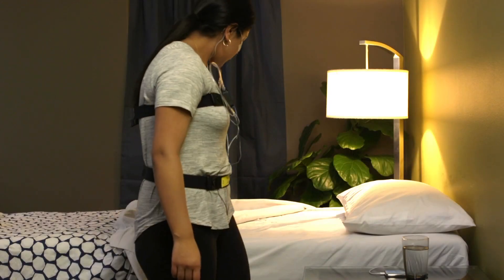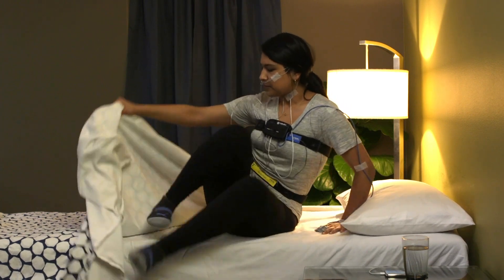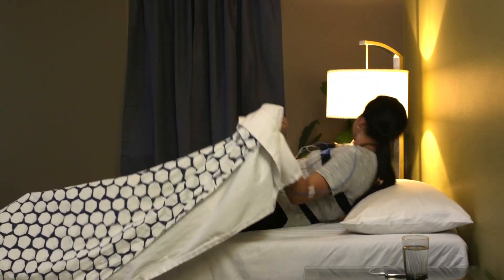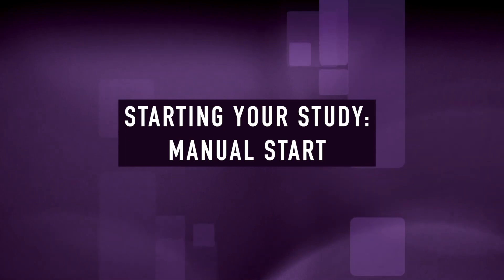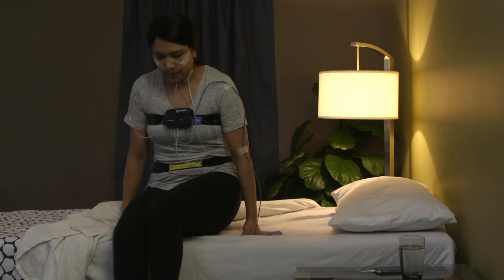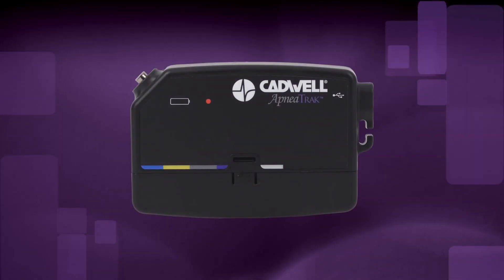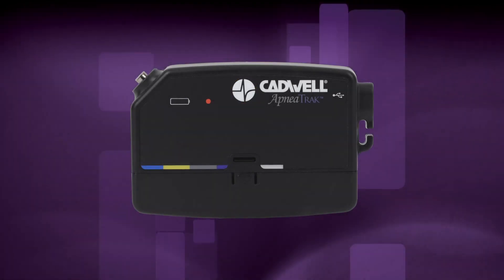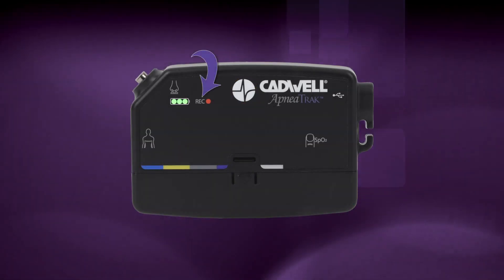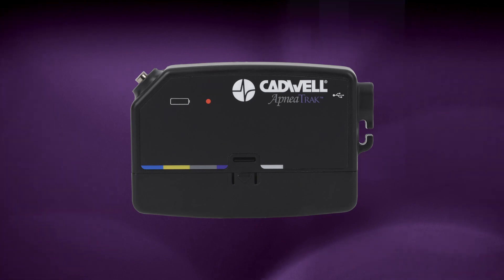If your provider set an auto start time, you don't need to do anything to start the recording — just go to bed and the device will start at the correct time. If your provider instructed you to hold the button to start the recording, press and hold the raised Cadwell logo event button for three seconds until the recording REC indicator LED on the apnea track appears. The LEDs will then turn off, but the recording has been activated.